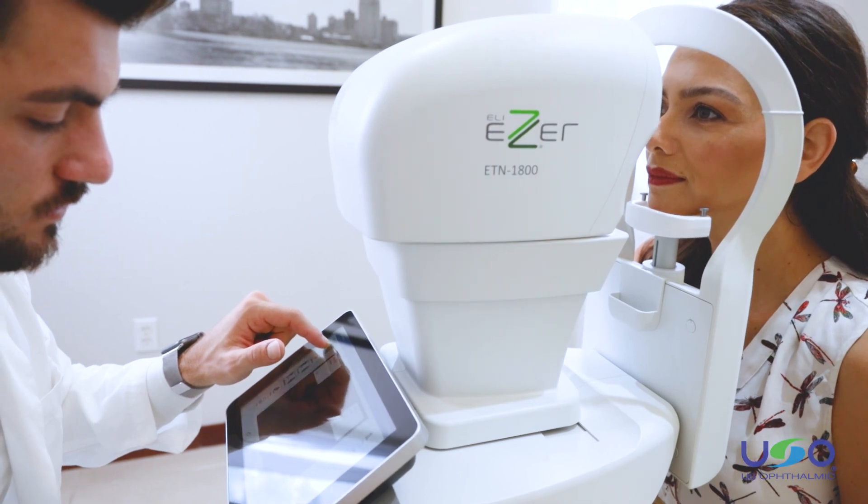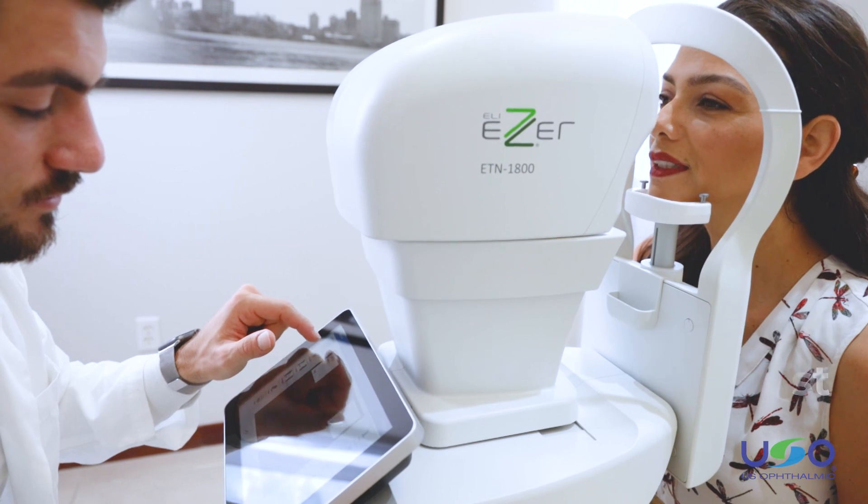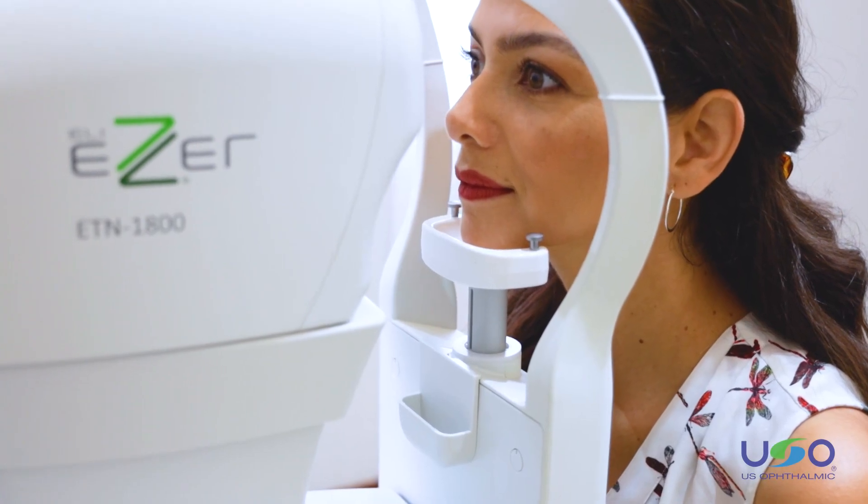Positioning and aligning the patient is easy. You can adjust the motorized chin rest to comfortably fit each patient using the up and down feature on the touch panel.